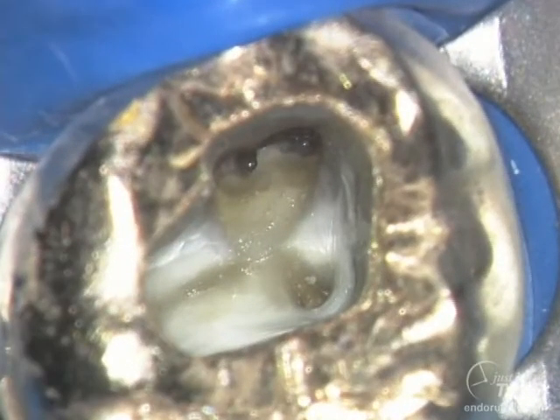In this occlusal view, notice how far mesial the MB2 orifice is. It has historically been said that the MB2 orifice is on an imaginary line from the MB1 to the palatal. You can see in most instances like this one, this is just not the case. Color is another great indicator and road mapping method for finding second systems.